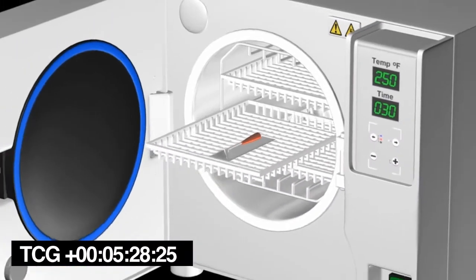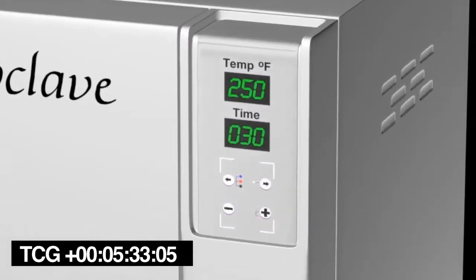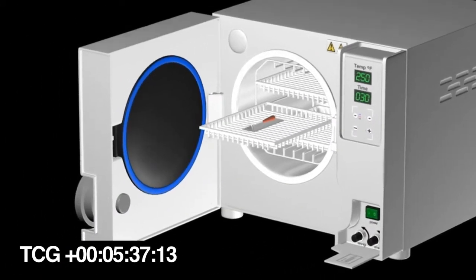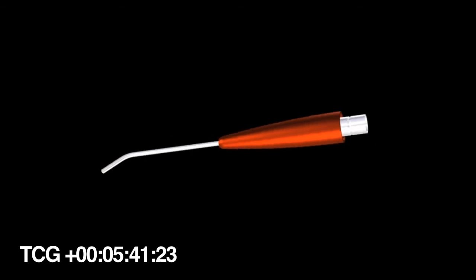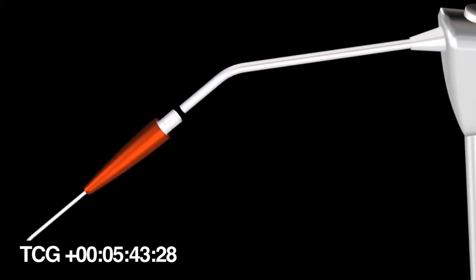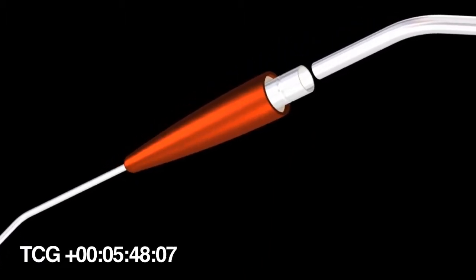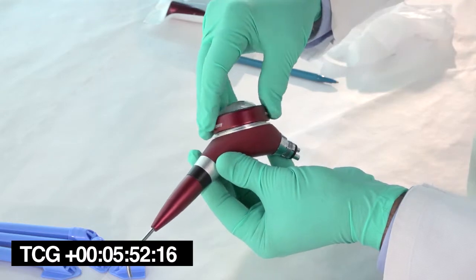Place the nozzle in an autoclave bag and then autoclave at 121 degrees Celsius, 250 degrees Fahrenheit for 30 minutes. Allow a 15-minute drying time. After sterilization, make sure there is no moisture in the nozzle by blowing air through the unit to avoid powder solidification in the air ports. Reassemble the air polisher for next use.